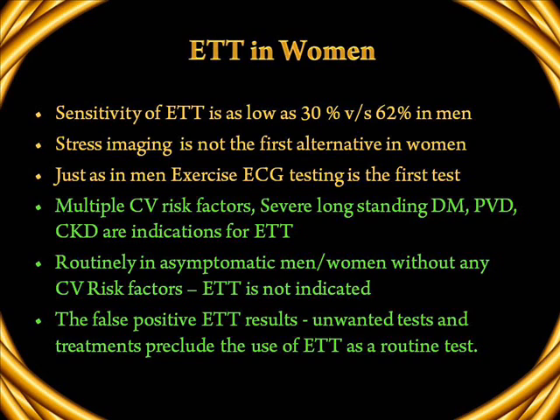Stress imaging is not the first alternative in women. Just as in men, exercise ECG testing is the first test. But remember, a positive result, the specificity of confirming the disease, is as good in men as in women. But the negative exercise testing result in women is not good enough compared to men to rule out disease if the test is negative.